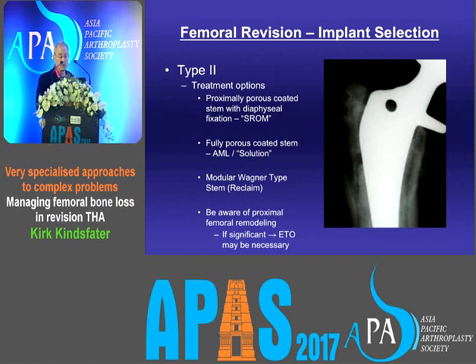Again, you can use a proximally ingrown stem with distal fixation like an SROM. Fully porous coated stems, i.e. the AML or Solution, work well. Wagner stems are good. Beware of proximal femoral remodeling.